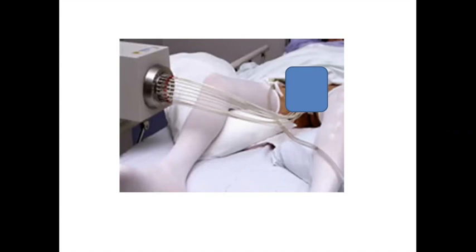And then once that treatment is finished, the tubes can come out of the prostate. So about 15 or 20 tubes are pulled unceremoniously out of the prostate gland with a bit of gas and air, a bit of Entonox, and painkillers as required, because that can be probably the most uncomfortable part of the day, in fact, because the anaesthetic is starting to wear off, but it only lasts about 2 or 3 seconds. So most people squirm briefly and then relax because everything's done and the tubes are out.